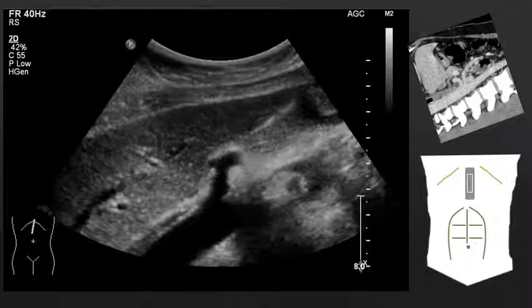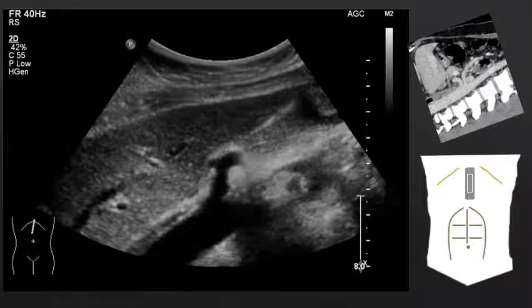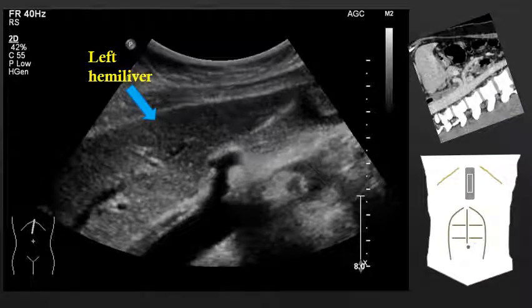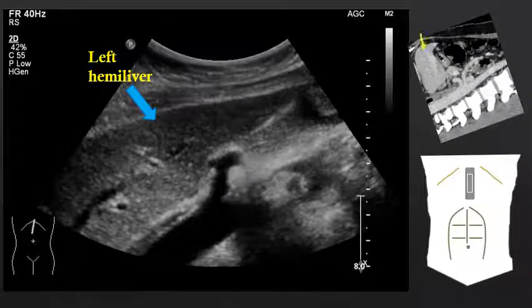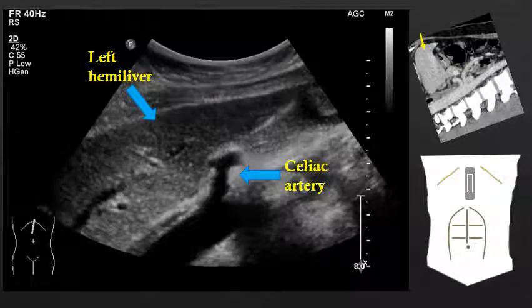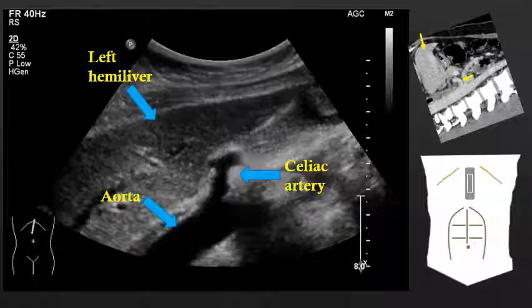If we move into a sagittal orientation, the left hemiliver remains within view as it is the most superficial solid organ in this location. We now see the celiac artery, which is arising from the aorta. These are the large vascular structures that are just deep to the left hemiliver and can be readily identified in a sagittal orientation.